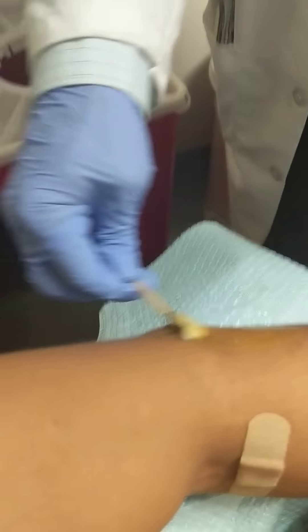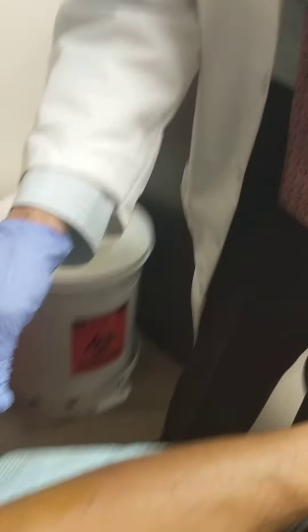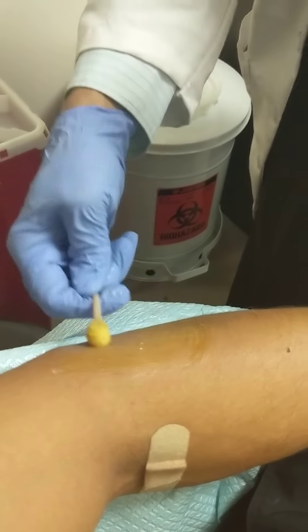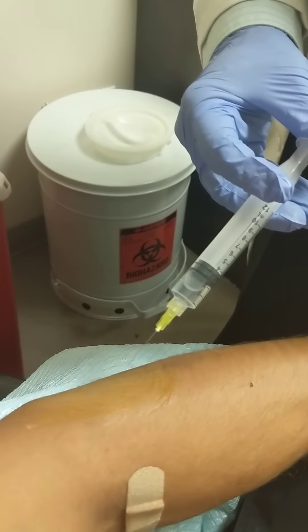We're cleaning it with betadine. And then we're going to put a small amount of local anesthetic in here because we want to make sure that it's numbed. Now we already put a superficial numbing cream as the first stage, and then a small amount of local anesthetic to numb up the skin.